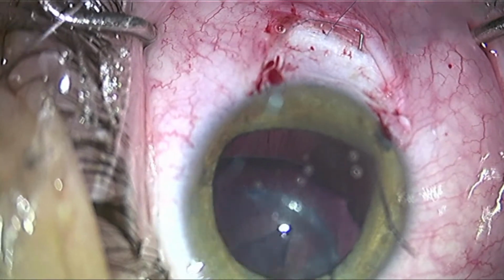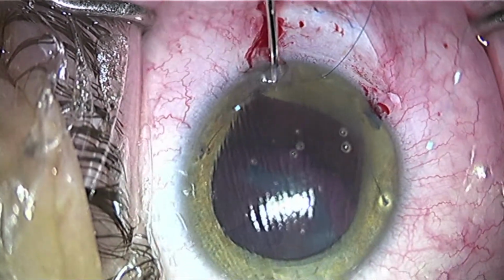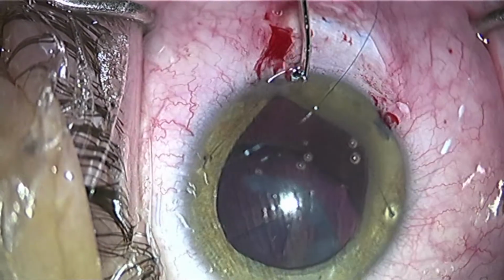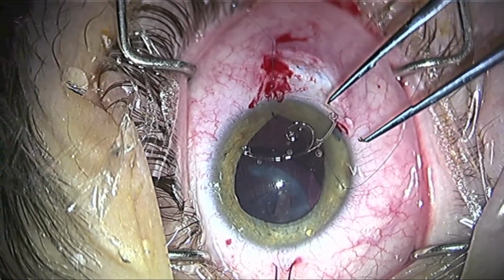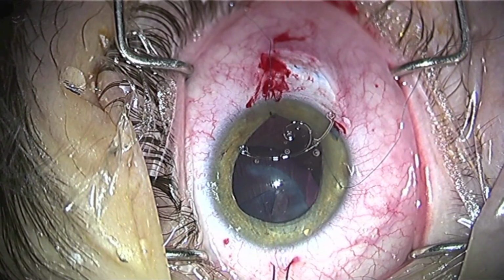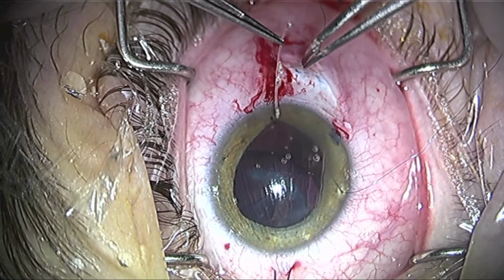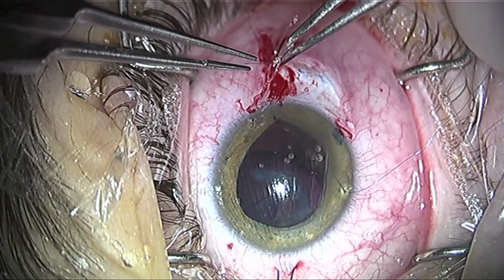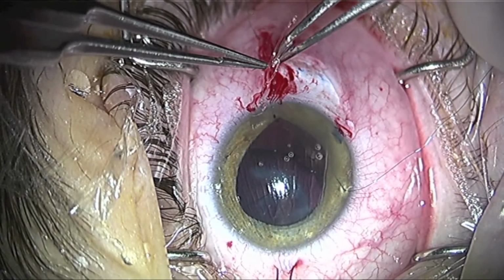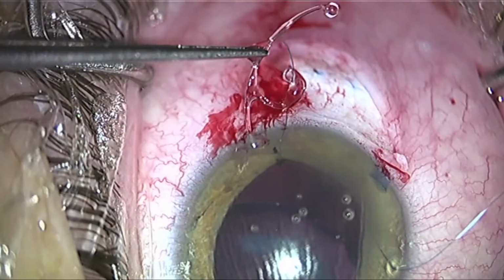You can then cut off one of these needles and go back in with a Kuglen hook and pull out the suture in its entirety. You still have one suture that's attached to a needle. The Ahmed segment is then brought into position and the 9-0 Prolene is threaded through that central eyelet. The Ahmed segment is now set up to be placed in the eye.